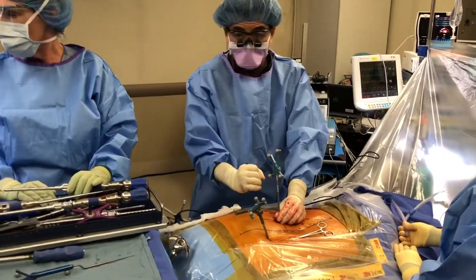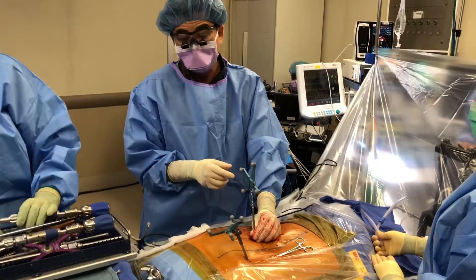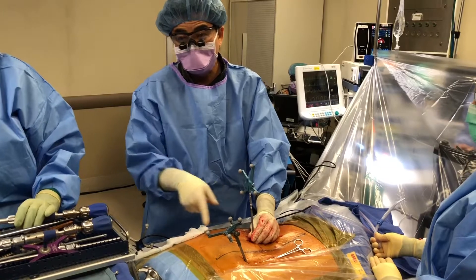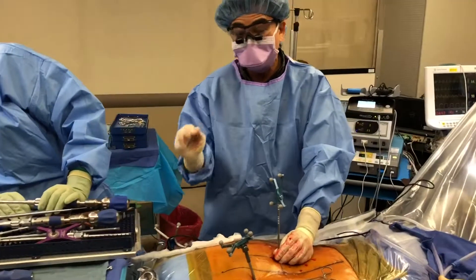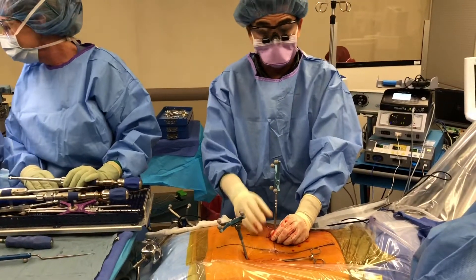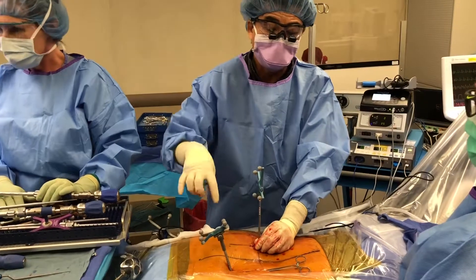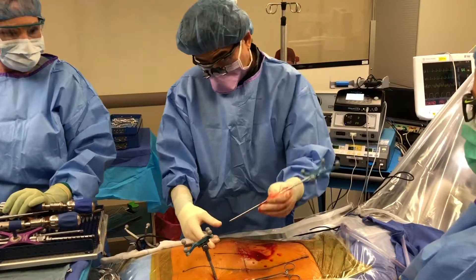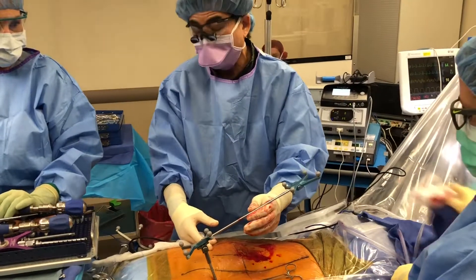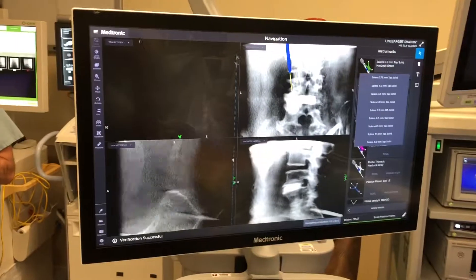Furthermore, if I had a retractor down there and I exposed the facet joint, I could visually double-check the bone location against what appears on the navigation screen. All those steps are called the internal validation step. It confirms that the relationship between the spine and the patient reference frame has not moved. Intermittently I'll also confirm the calibration — that the integrity of the navigation system is intact.